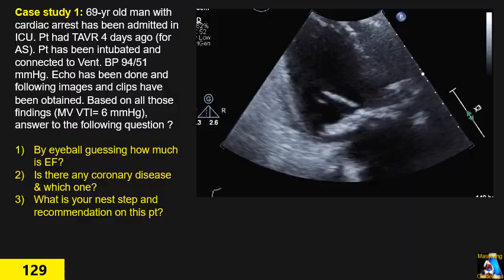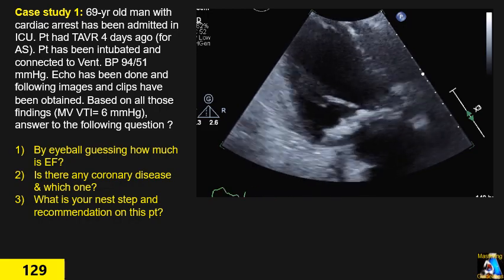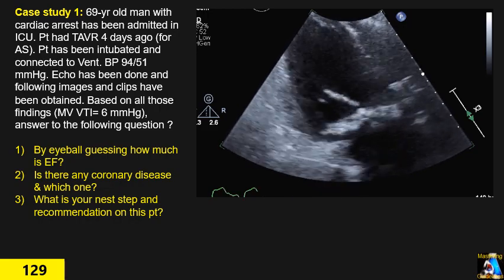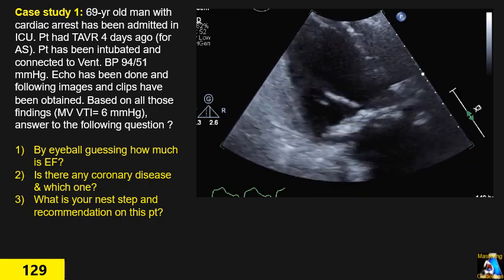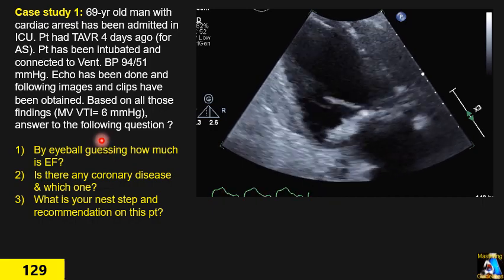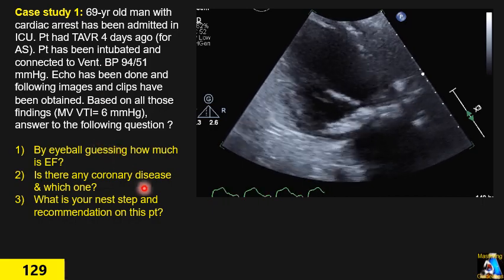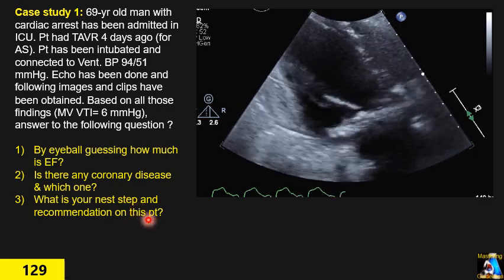Hi everyone. In this case study 12, we have two case studies. Besides the main question here, I'm going to ask some questions on each of those clips, so you have to answer those questions too.